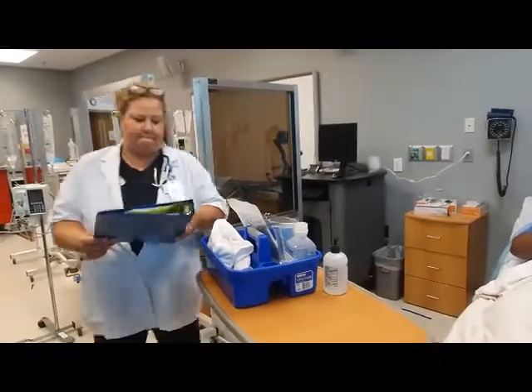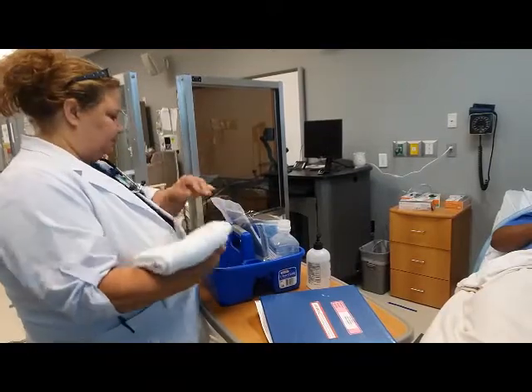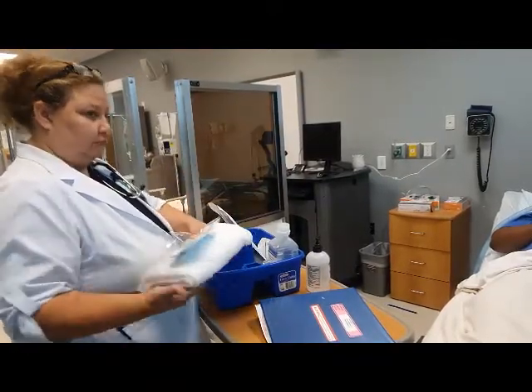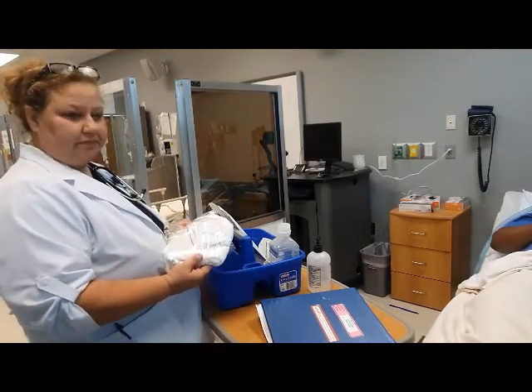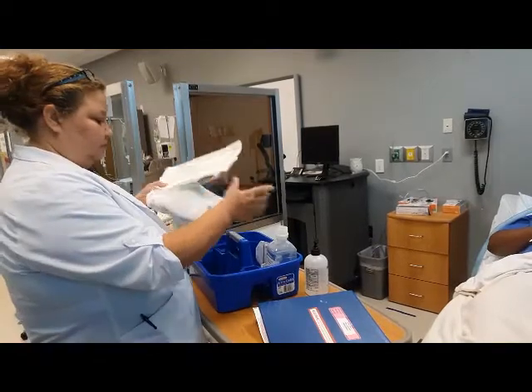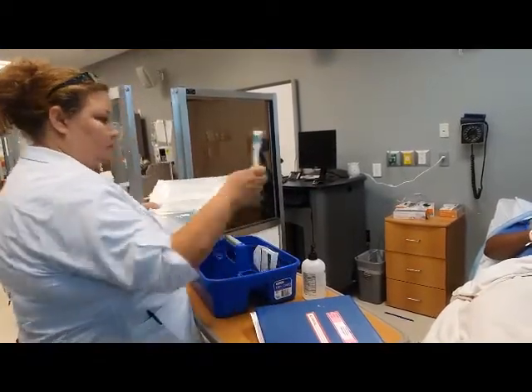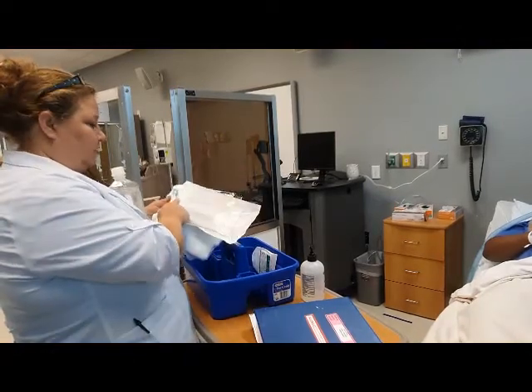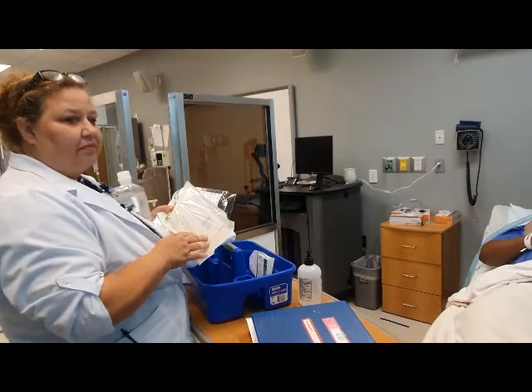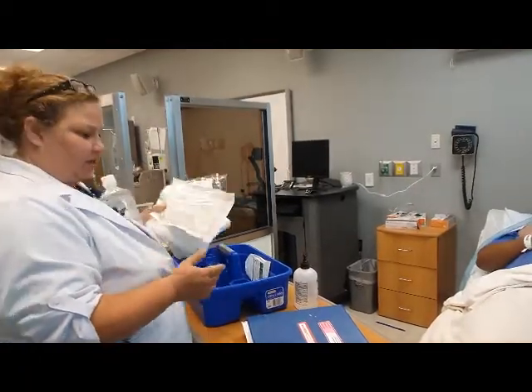All right, so you gather your equipment: the towel or drape to protect the patient's chest, mask with face shield if body fluids are anticipated, suction catheter kit, your sterile saline solution, oral care supplies, wall suction source, which will be in the room, and your bag mask device attached to oxygen. I will show you the bag mask when I enter the room.